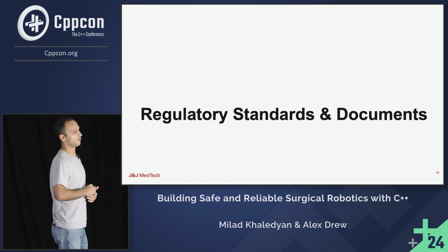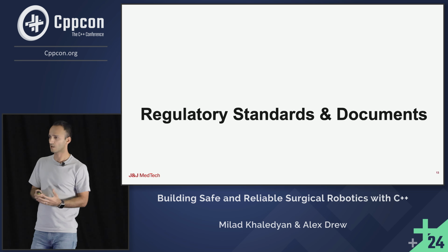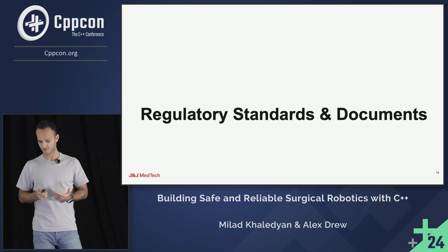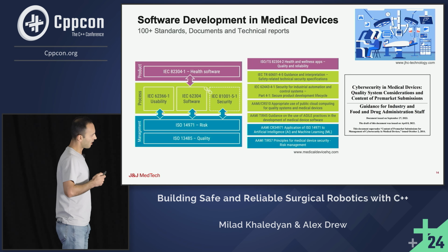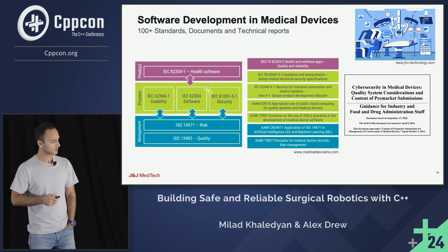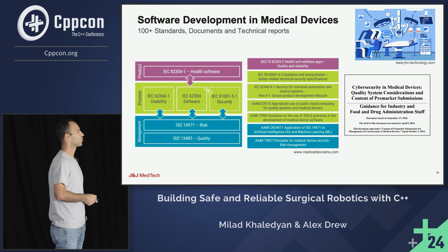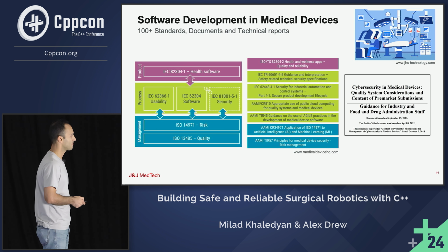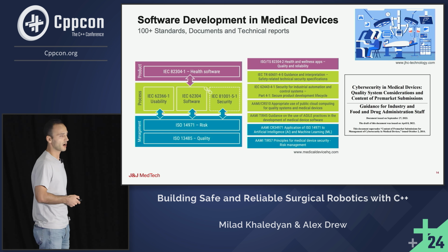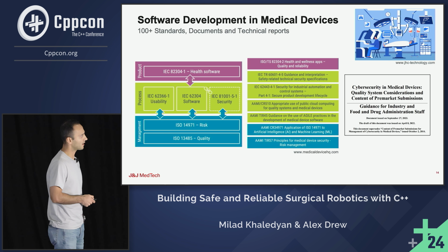So ever since, governments, a lot of regulatory agencies, and the medical device community have gotten together to address the issue of software in medical devices. And we have tons and tons of different standards, reports, and documents in medical devices to ensure software is safe. They go from quality management system standards, to risk management, to usability, health software, security, application of agile to medical devices, AI and machine learning guidances, and specifically cybersecurity.